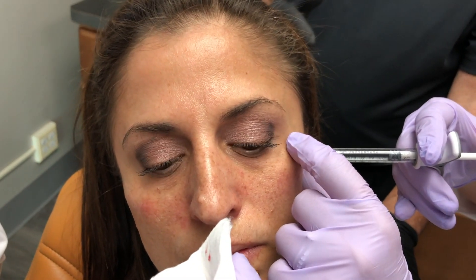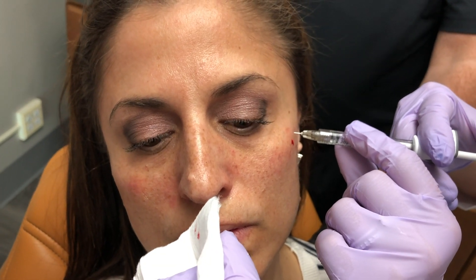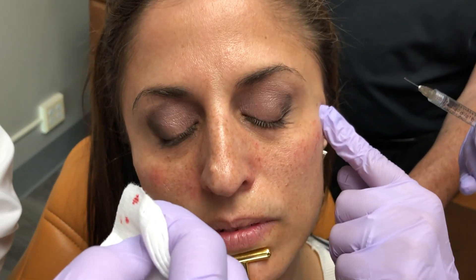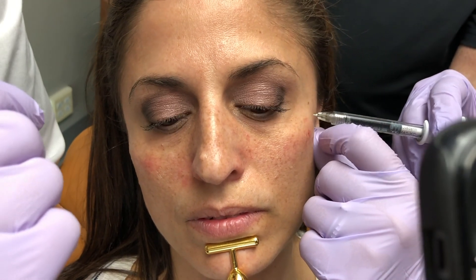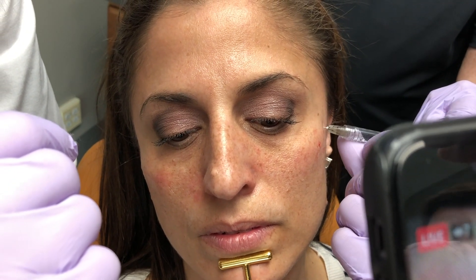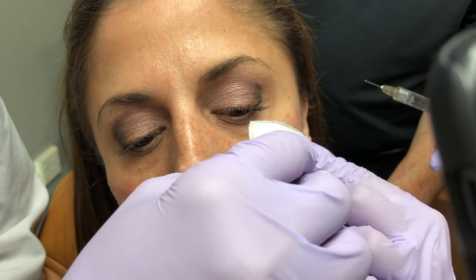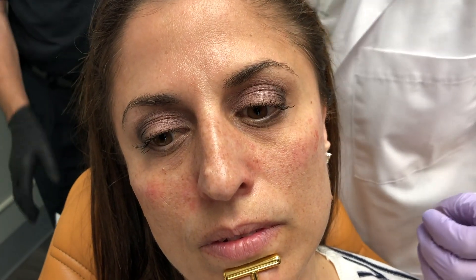You never want to inject while you're straight on bone. She is aspirating and then delivering — she's never delivering more than about 0.05cc as a bolus, because what we're always going to fight against and prevent is vascular occlusion or vascular compression. It's important to always keep that needle moving, so she's going to deliver some retrograde injection as she comes out. You can see it doesn't take long to deliver some volume here.